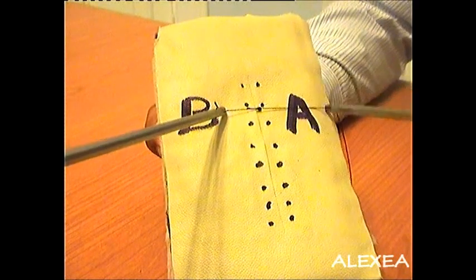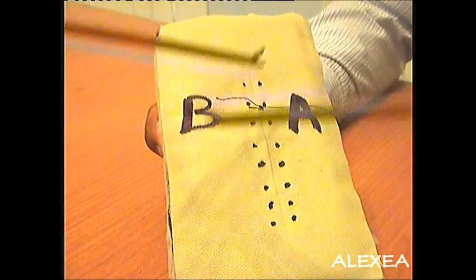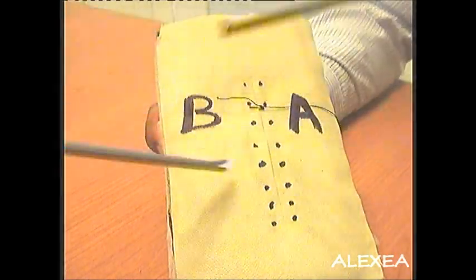This exercise must be done repeatedly so as to get the feel of the suturing in the direction in which it has to be practiced. This is extremely important. End of lesson number one.